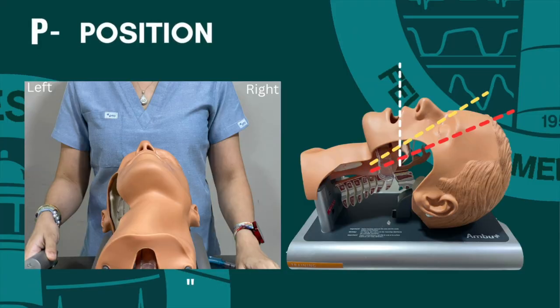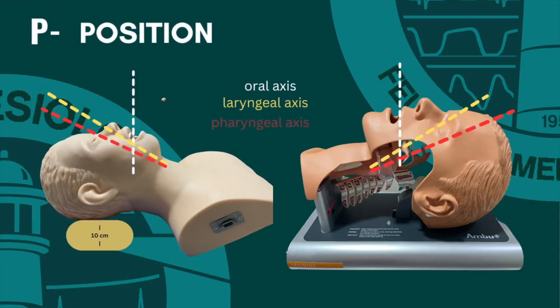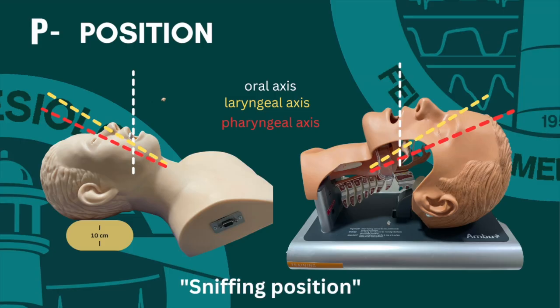After checking your equipment, stand behind the mannequin with the head in the sniffing position. A successful intubation involves proper positioning to align the axes for visualization. The oral axis is where we view the mouth, the laryngeal axis is where the glottis lies, and the intervening pharyngeal axis connects them. All three axes must be aligned in order to view the glottic opening.